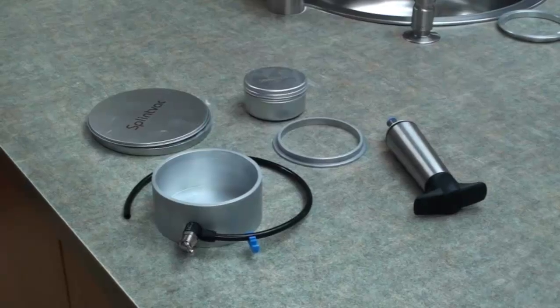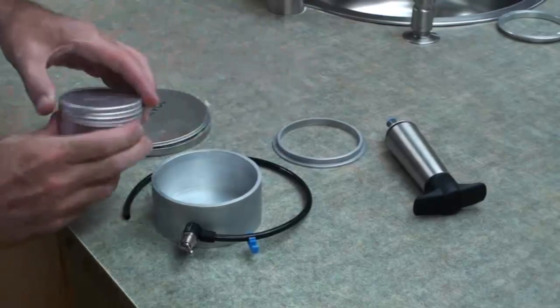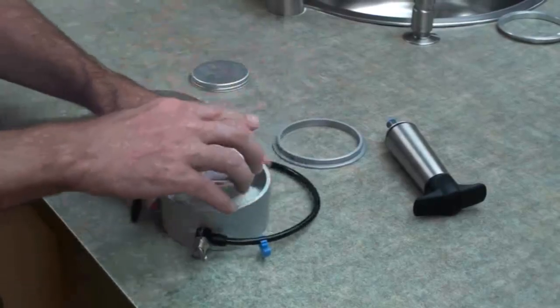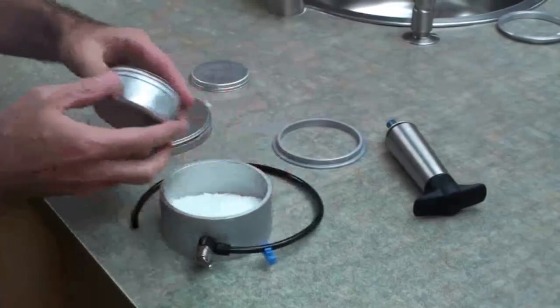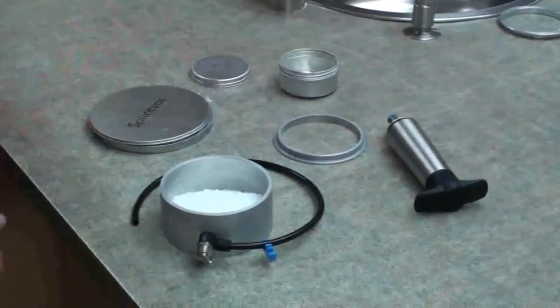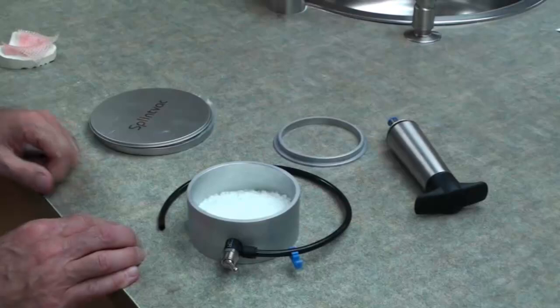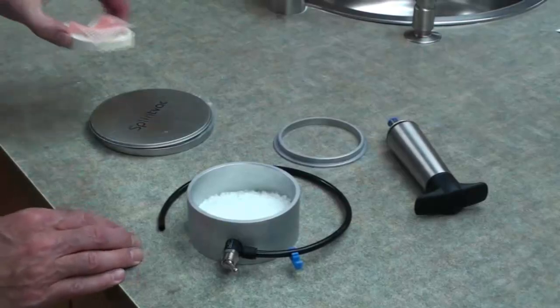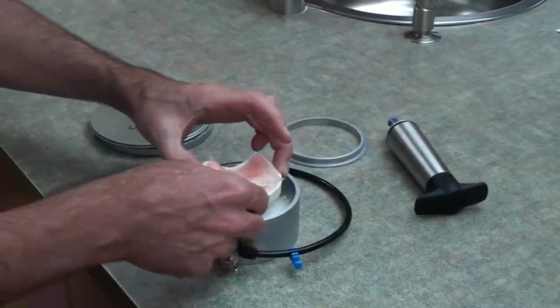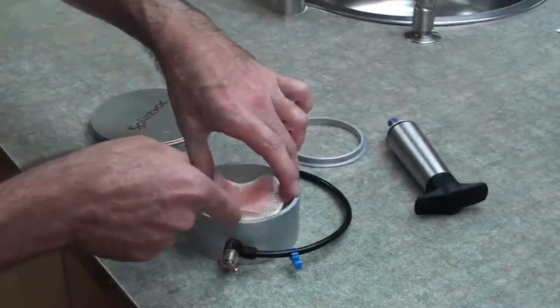From the splint vac complete kit, open the container with the acrylic beads and place them into the chamber. These beads will stabilize the model and allow you to modify its height. Place the model inside the splint vac unit, and with a reciprocating motion, lower the model to just below the top of the rim.